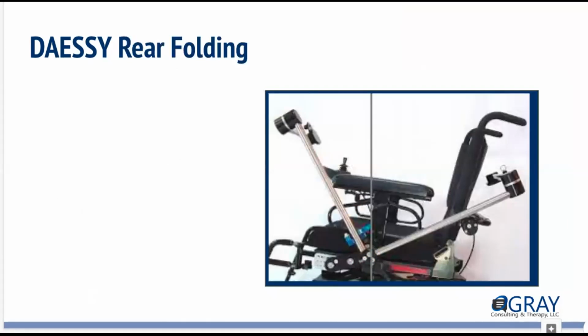The other one that I really like for the keep it simple, it's more challenging to get on the chair and mount correctly, but can be more wonderful for some individuals, is this Daisy rear folding. So this mount does not come off the chair. You do need to be utilizing a power chair or a tilt chair with custom seating, so that it's a heavier chair, because the mount is a little bit heavier itself.